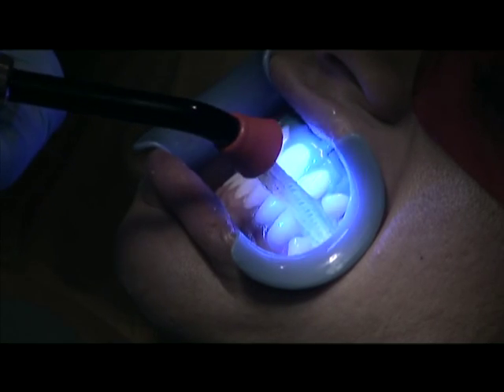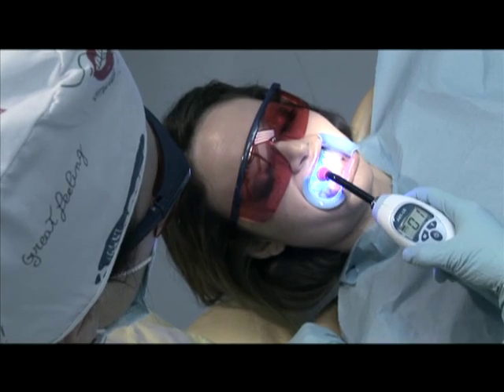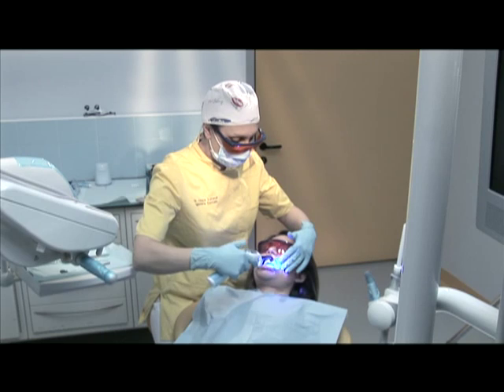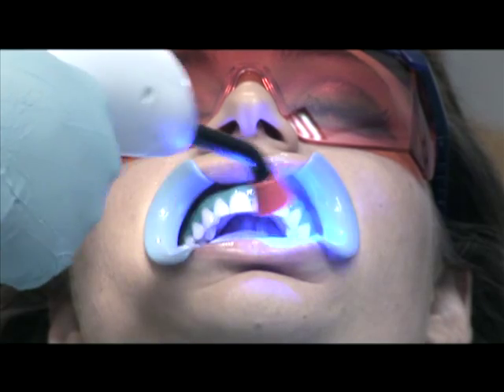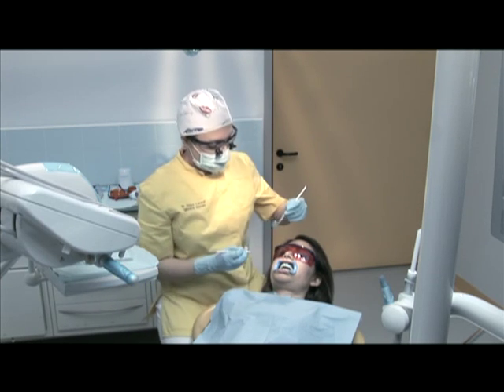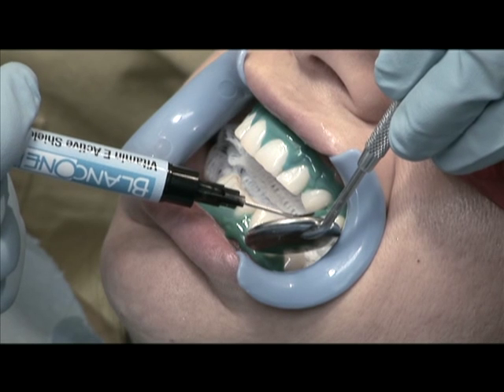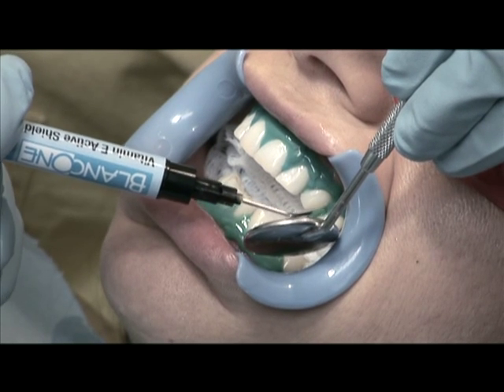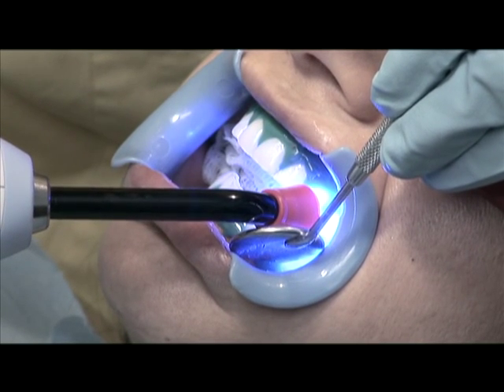If correctly positioned, the Blanc 1 active shield will not detach, even if the patient wants to rinse during the various operations — which would otherwise force you to start again from the beginning. Continue in the lower arch, then use a mirror and a probe to check that the gum edges have been properly isolated. Use magnifying goggles to check for any air bubbles or points that have not been correctly isolated.